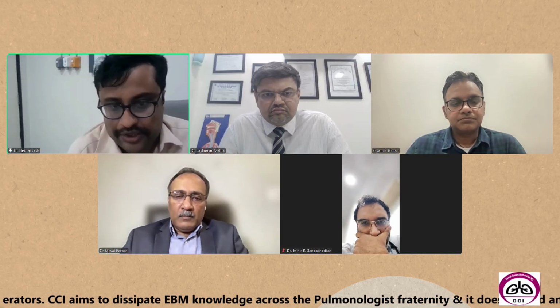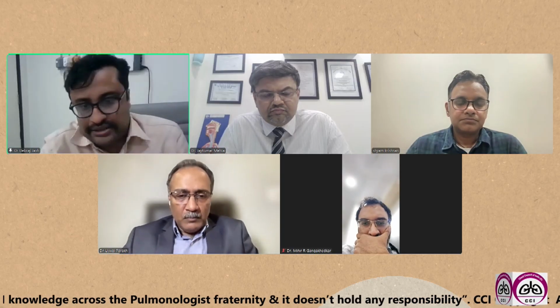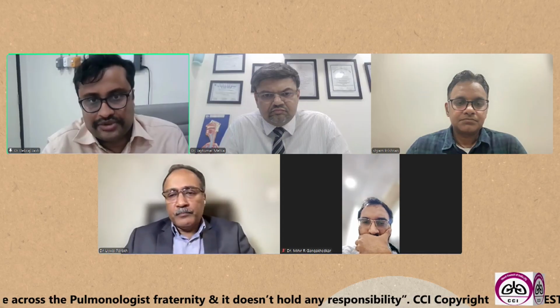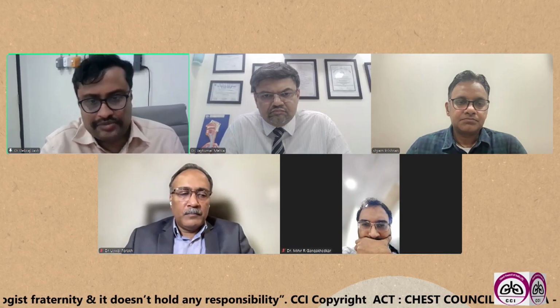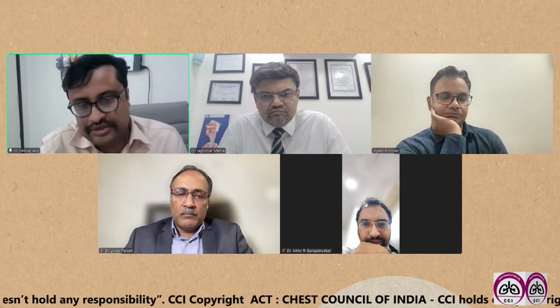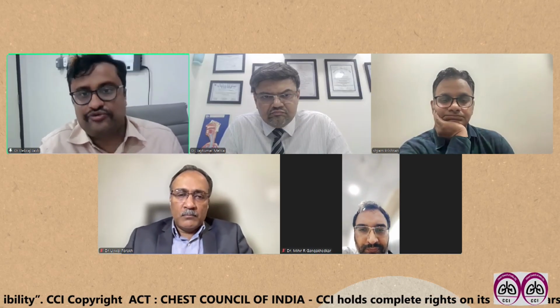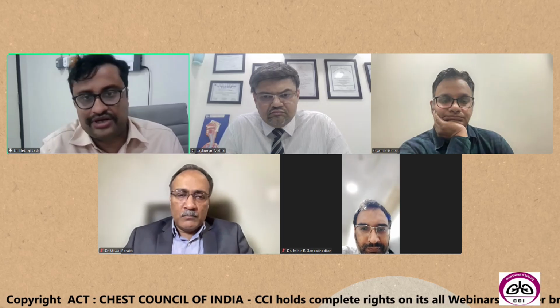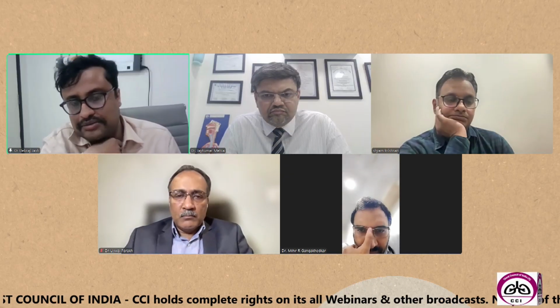Now, another question I will ask every one of you. Coming to the complications, we always know that the most common complication while doing EBUS is bleeding. So how do you tackle the bleeding? Suppose you have a severe bleeding, I will go to Mihir, with the EBUS scope. Will you keep the EBUS scope intact, or will you remove it to have better suction? Is there any use of Fogarty's? You have a severe bleeding while you have punctured one of your nodes.